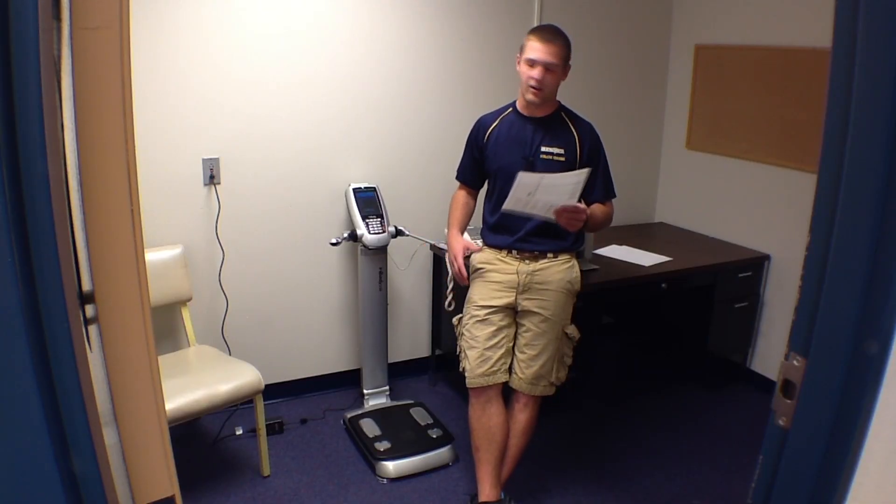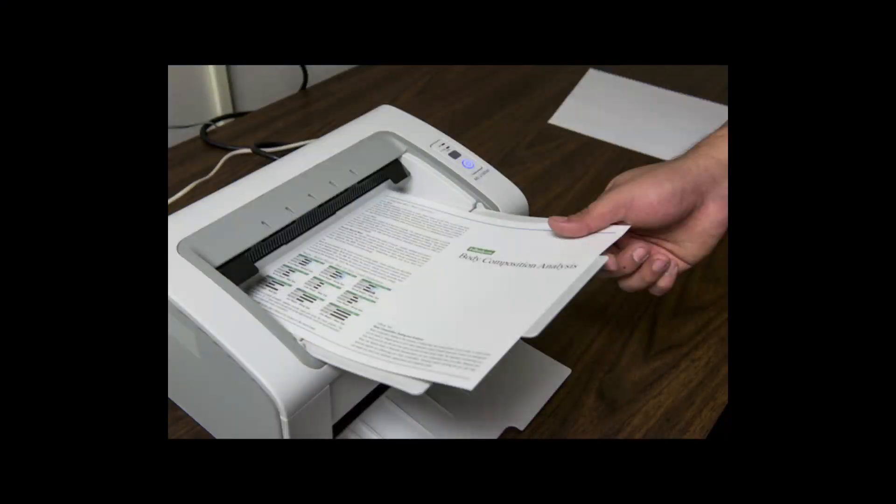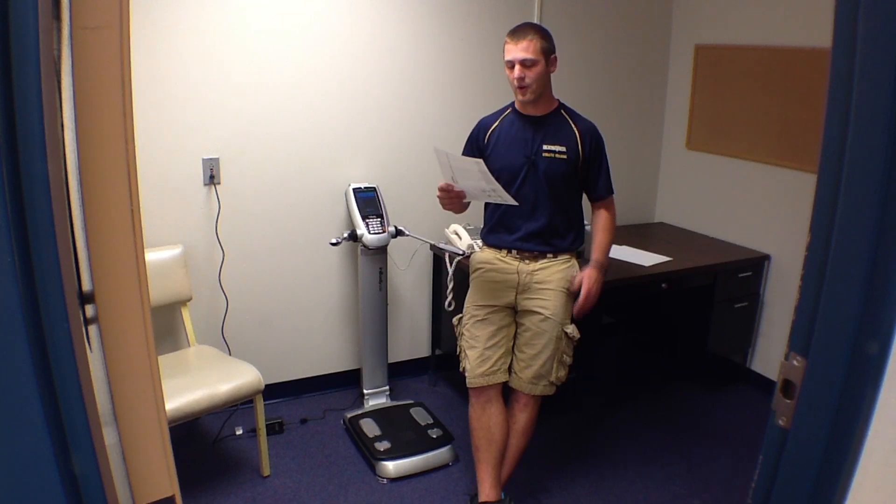It can also do an obesity analysis for you, letting you know about how big you should be and how tall you are.